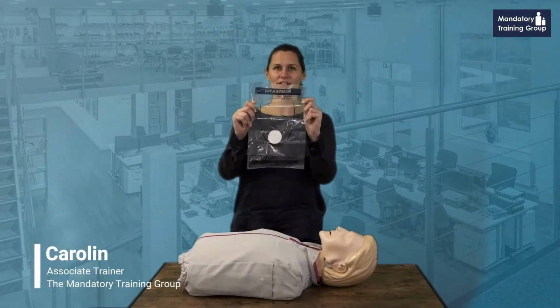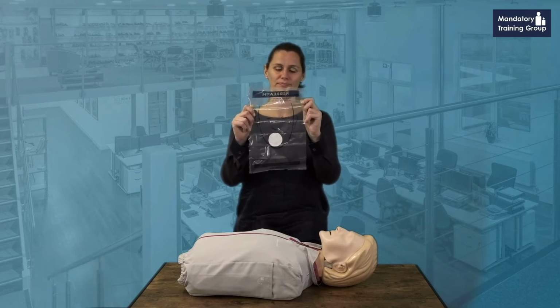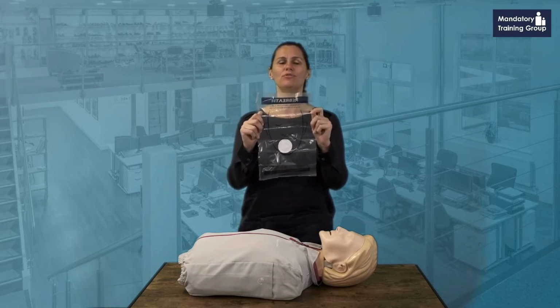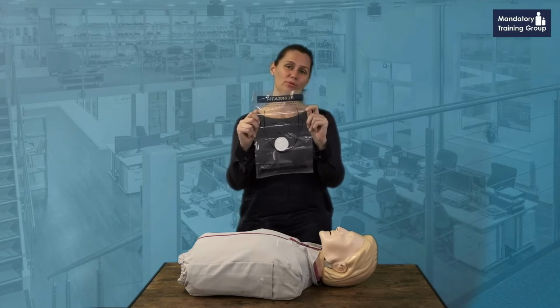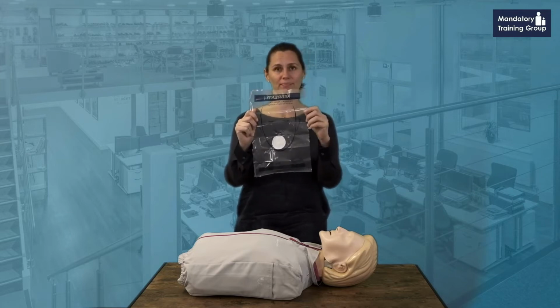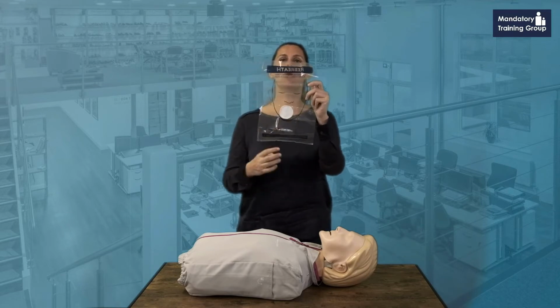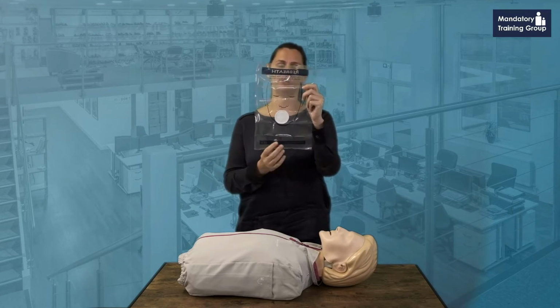This is a face shield, and you should have a face shield in your first aid kit. Why would you be using a face shield? Because it protects you from any bodily fluid from the casualty when you're giving rescue breaths during CPR. How are you going to use it? You put that white part onto the casualty's mouth while you're breathing through to give rescue breaths.